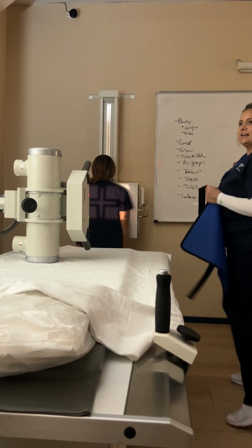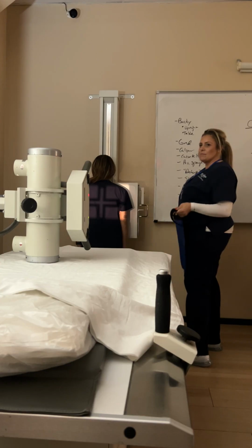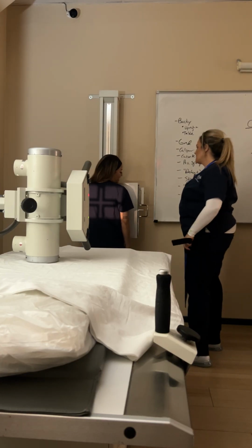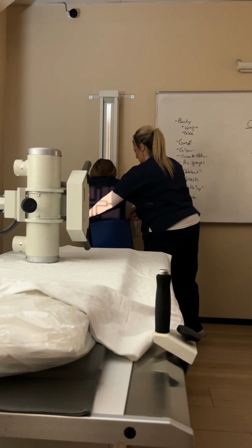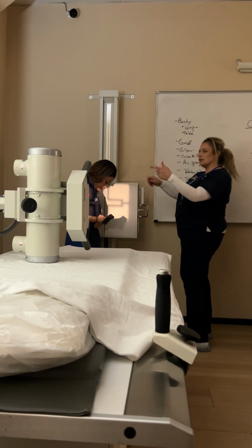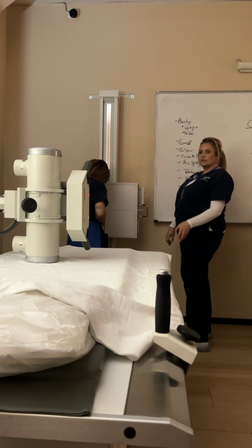Are you going to shield? Yes. So you were right. Try to shield before. Try to have the patient shield themselves. It will save you from a lot of lawsuits. So exactly like she just did. Okay, so do that before I start doing this, or while I'm doing this? Have her step, or just.